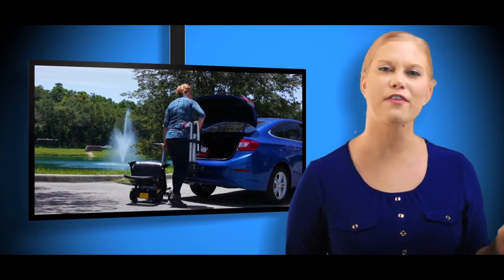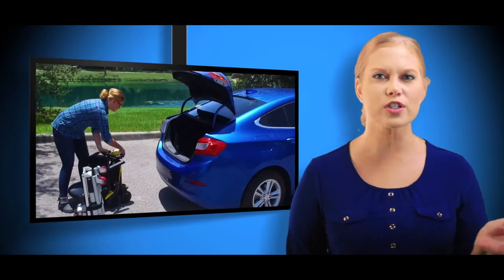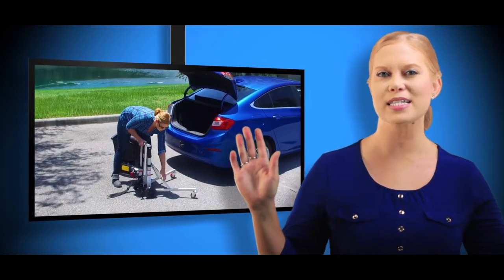It only weighs 22 pounds and fits easily into the trunk of virtually any car. The Hercules can lift folding scooters that weigh up to 60 pounds, and it runs off the battery of your scooter. No outside power source needed.